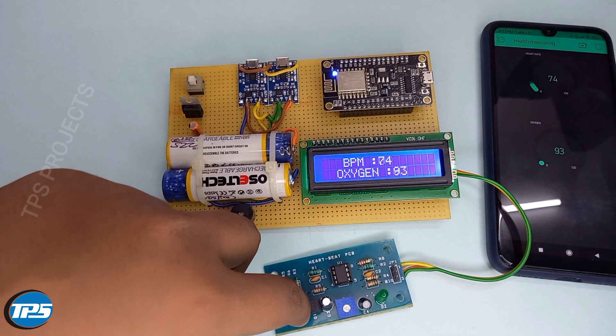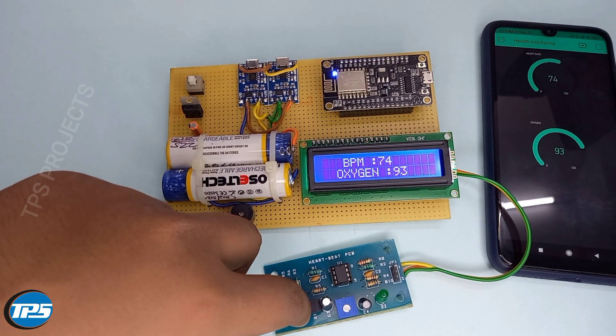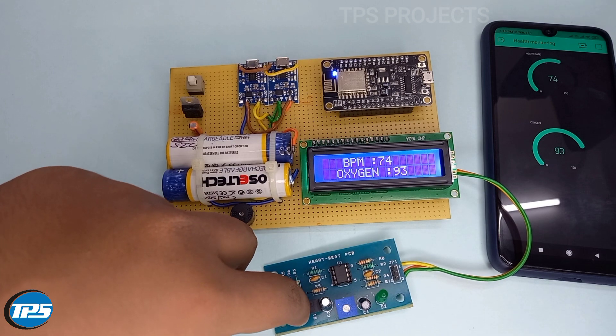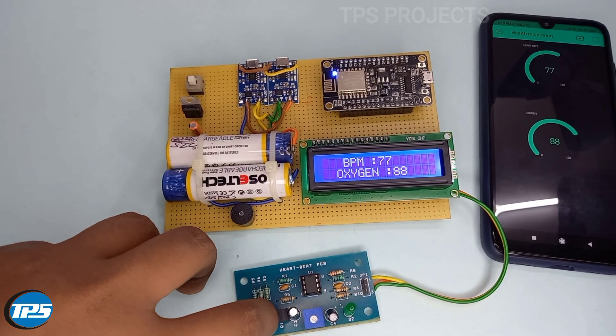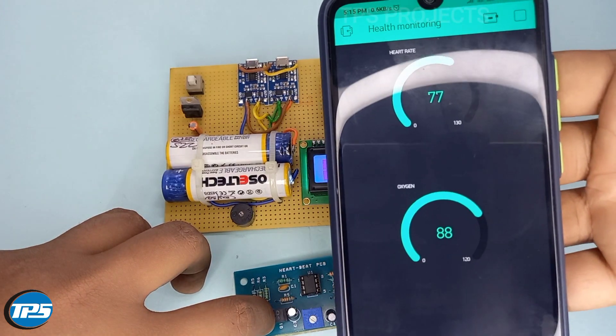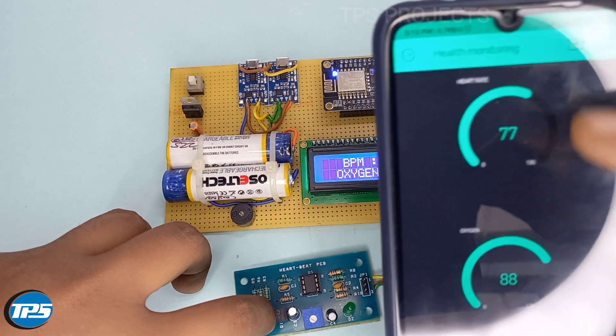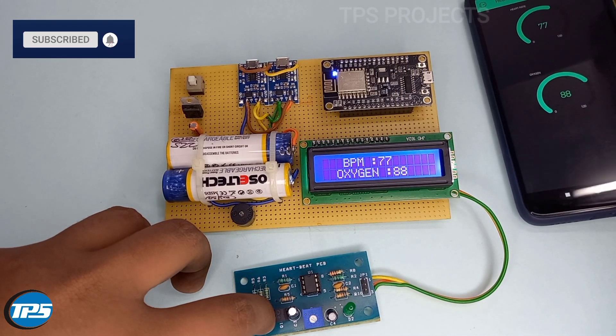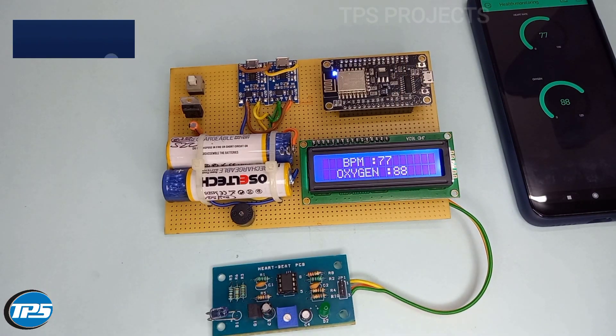It takes 30 seconds for detecting the heartbeat and oxygen level. Now in the Blynk app we can see the oxygen level and heartbeat rate. Now we can see the next reading.